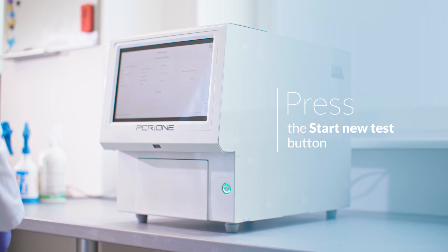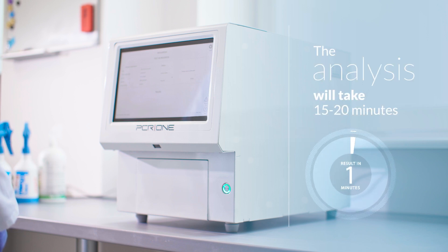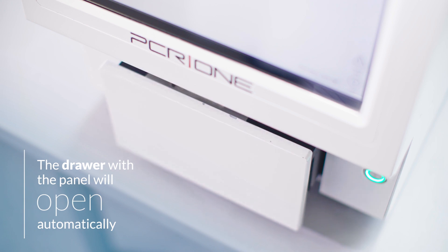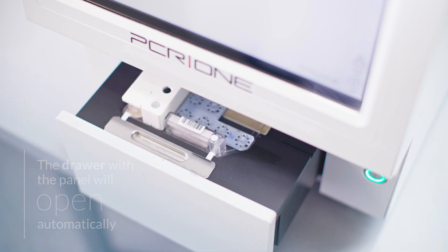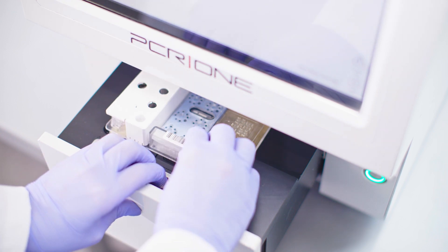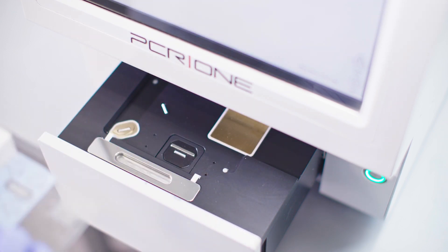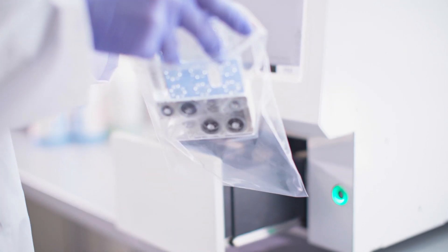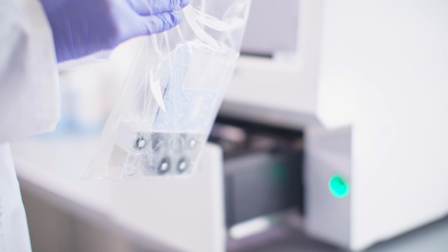Once the drawer is inserted, the device will start an automatic scenario of genetic material isolation and PCR reaction, which will take 15 to 20 minutes. The device will then analyze the products obtained and display the analysis result. At the end of the procedure, the device will automatically open the drawer with the panel. The panel should be immediately removed from the drawer, front edge first. The panel should then be placed in a resealable zipper storage bag and disposed of in a biohazard waste container.